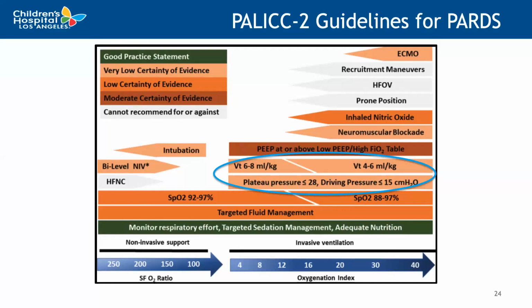So I do want to draw your attention to both the tidal volume and the pressure limitations to effectively guide lung protective ventilation strategies. So first, Dr. Amato published in his New England Journal of Medicine paper that there was a mortality benefit for those patients in which the driving pressure is limited to 15 centimeters of water or less. And so that's where this driving pressure less than or equal to 15 comes from. And that equates to about a plateau pressure of less than or equal to 28 to be lung protective.